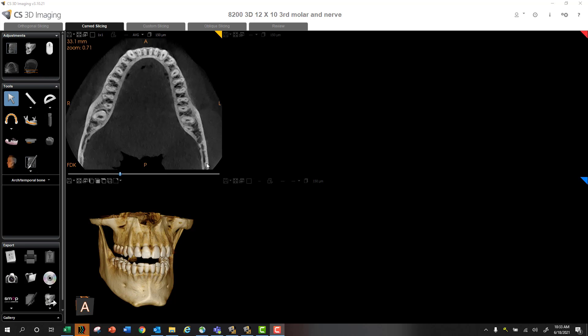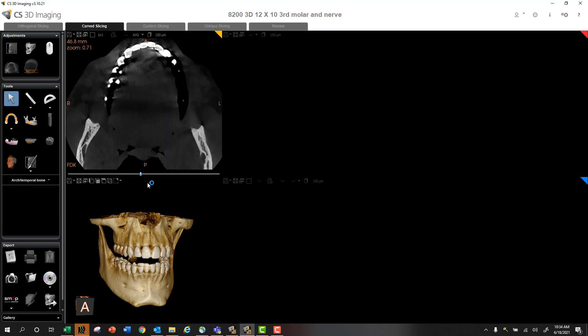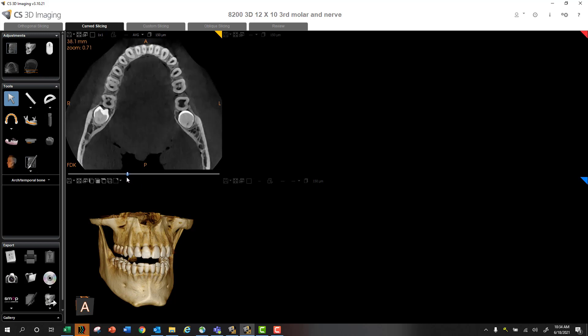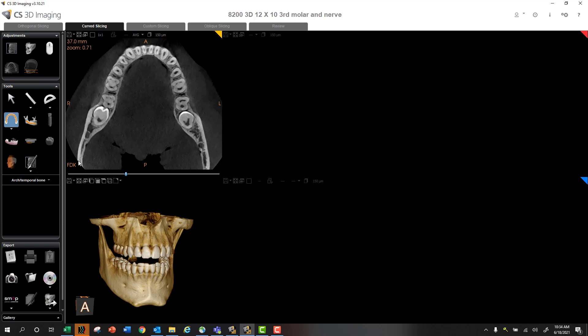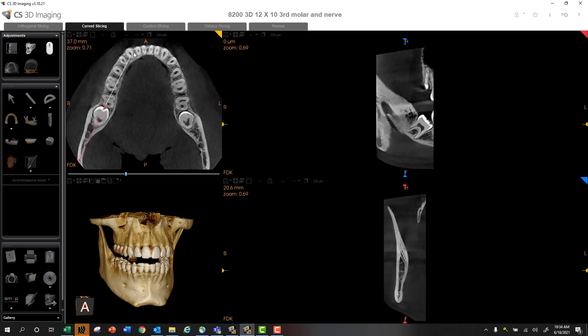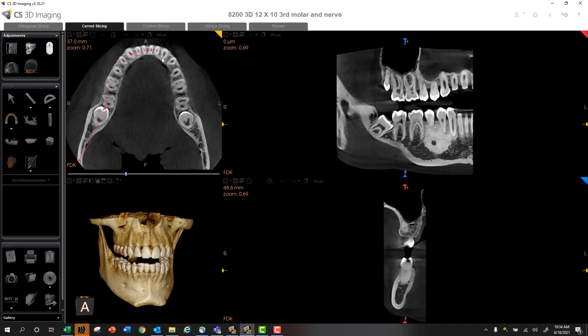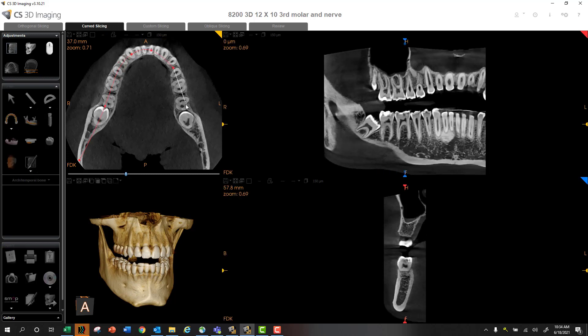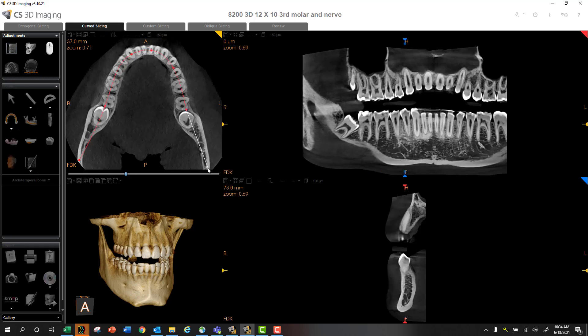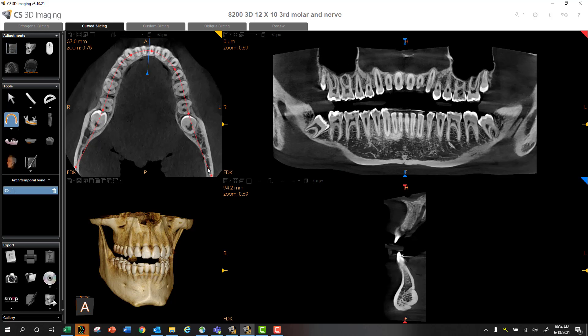I think a lot of us are taught initially, when we map or create our panoramic curve, we're going to move our axial slice to a good position where we see the cortical bone of both buccal and lingual aspects, and then to simply go down the center of the bone. This technique works just fine.